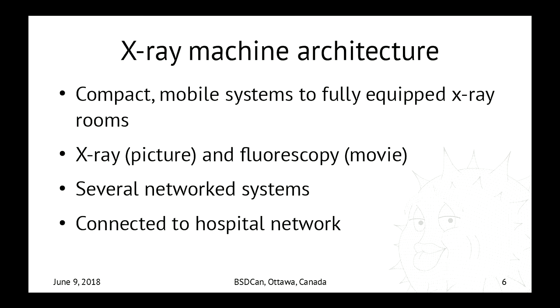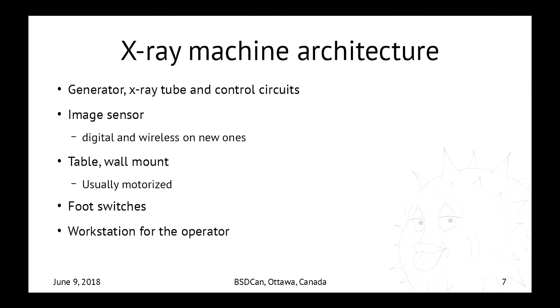Obviously, that covers the X-ray part as well. Inside, there are several network systems. This is just Ethernet, nothing fancy there. And these machines have to be connected to the hospital or doctor's office networks. They have to, because of the workflow. Oh, actually, this is a slide too far.